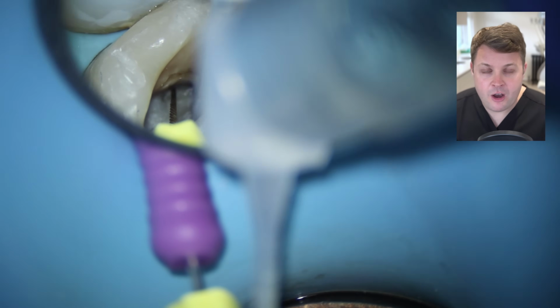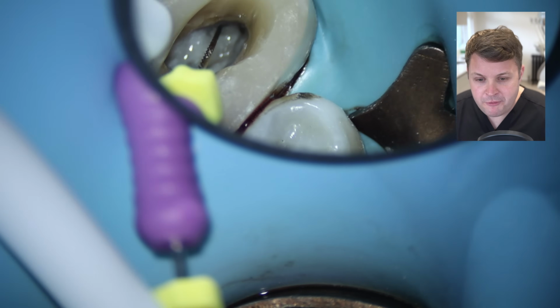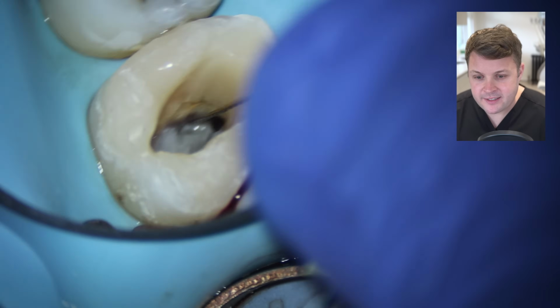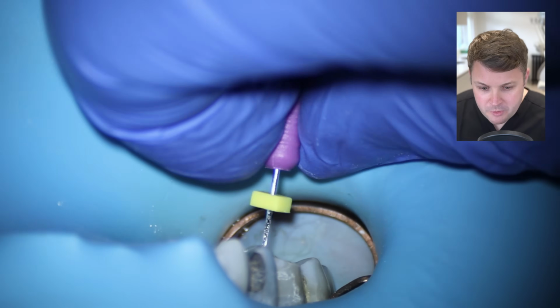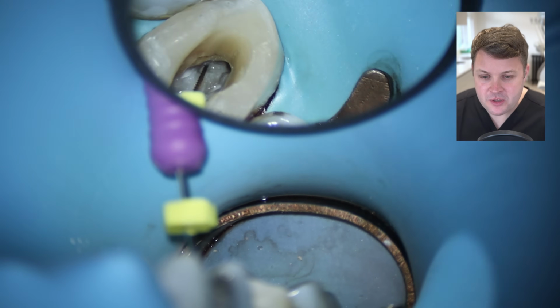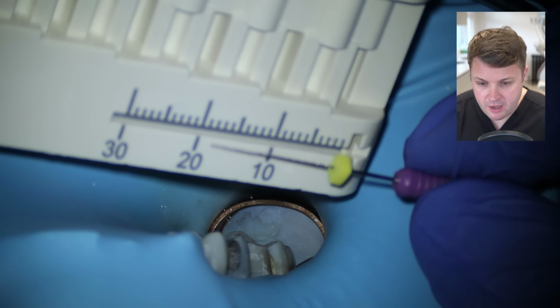And out the corner of my eye, when I was negotiating down the MB2, I felt like I could see the hand file in the MB1 as I was negotiating in the MB2. However, when we have a quick look, I obviously can't see that. So the furthest that I've got is 17 millimeters in the MB2 so far.